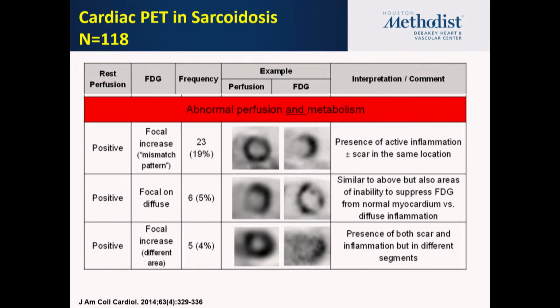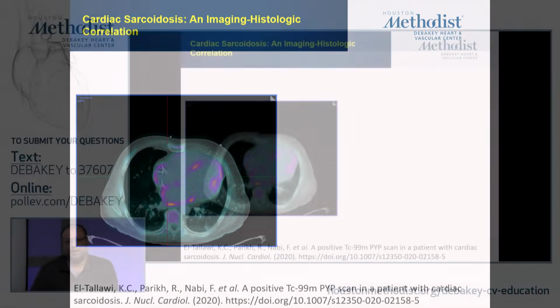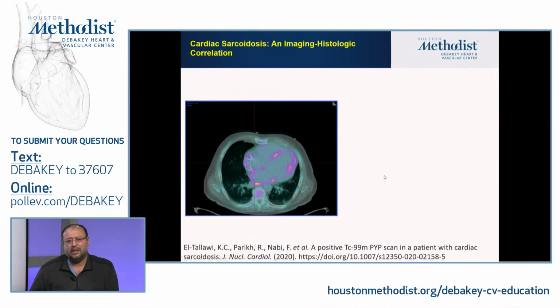We also couple that with evaluation of the MRI at the same site, and Dr. Shah showed before the slide on how we can potentially combine them. Now, there's always an intention to do a biopsy to identify the primary pathology, because remember, FDG, like late gadolinium enhancement, is not specific for the disease.